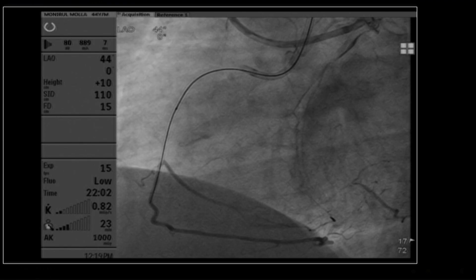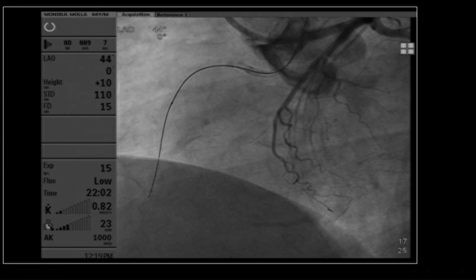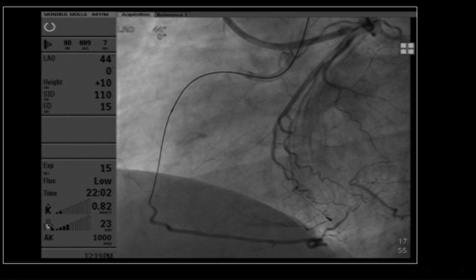You see, the issue here was first to enter that occlusion with the side branch in front. The side branch being there, every time I was going in the side branch. So one way is to occlude the side branch with a balloon, and the other is you use a tougher wire. Now Gaia 2 is not an easy wire. It's not a very soft wire, I can tell you. It's less than Gaia 3, but it is very strong.